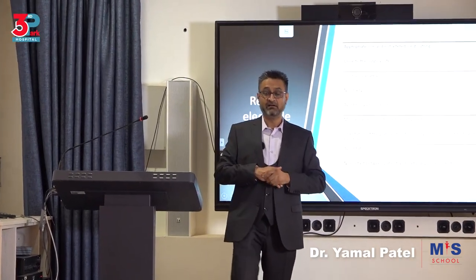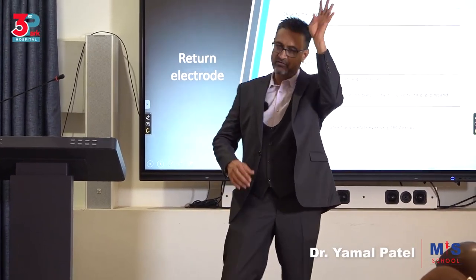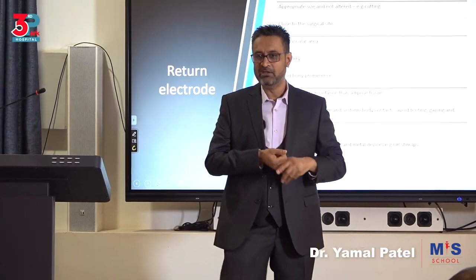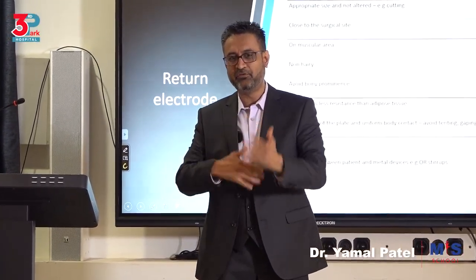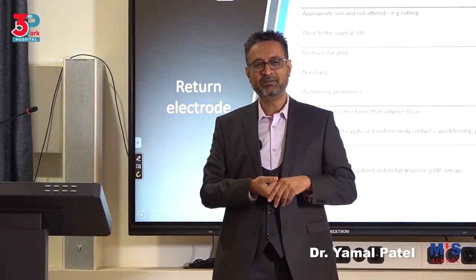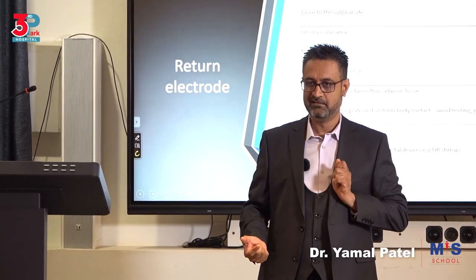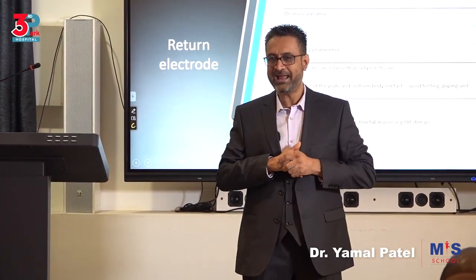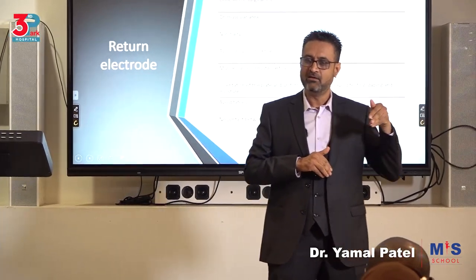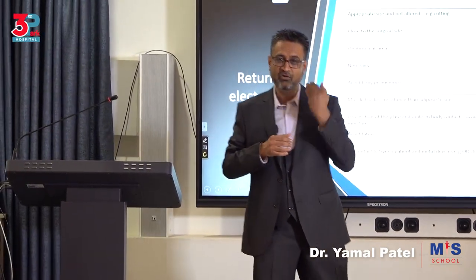You maintain enough current. Also, the metal ones, I don't know if you've seen the old metal ones. People used to put wet saline or wet fluid, or gel, and then roll it and put it in. Why? They're trying to increase the contact. So people say, oh, they don't want it wet. Nothing happens if it's wet with saline, because it has electrolytes. But if it's wet with betadine, or water, or spirit, it has no electrolytes. So then it will create a barrier. It will not burn, but it will create a barrier and therefore not enough contact, and therefore you'll have a problem. You understanding?